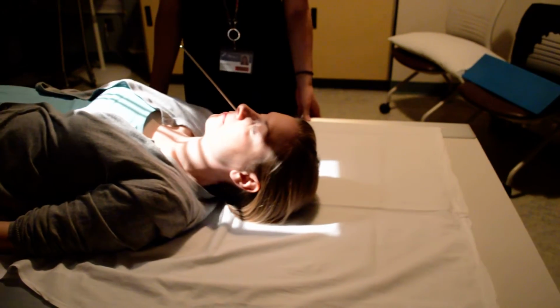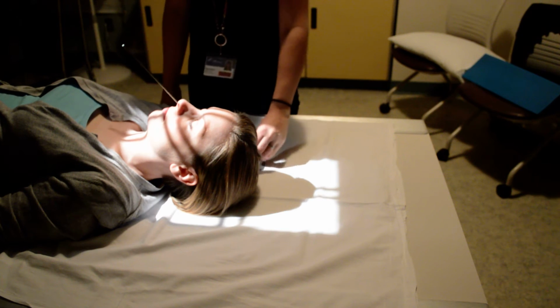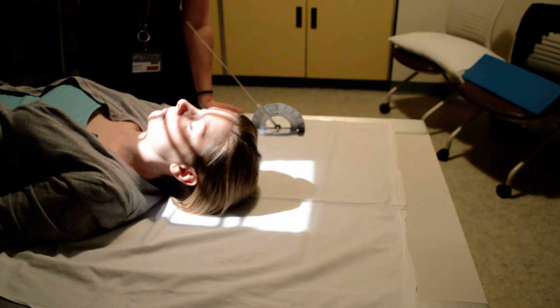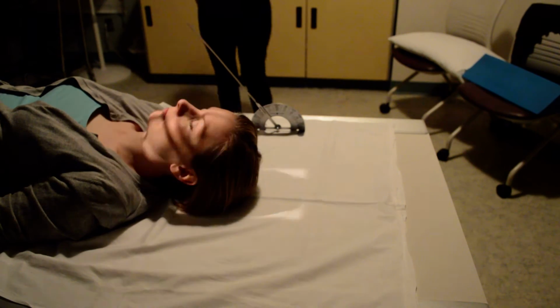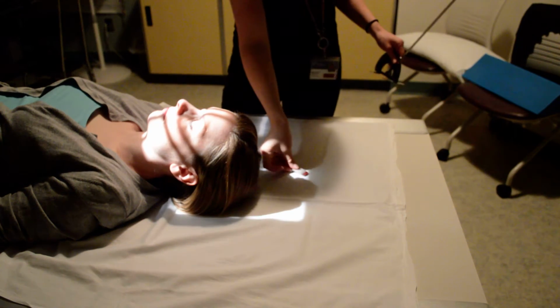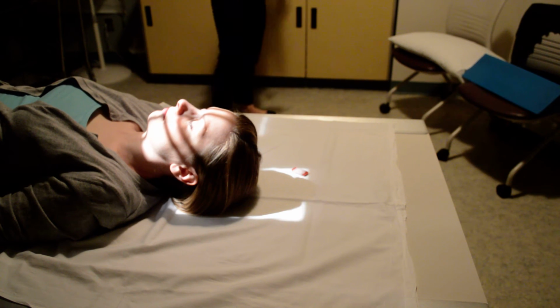So before, when we were doing reverse Waters, we were exiting at a canthion. This time we're going to be entering at a canthion, mid-sag, and then we can most definitely collimate to the outer margins on this. So it's okay for you to clip the vertex, just keep in mind you want to get that entire mandible on there. You can use a right or left marker, so I would just go ahead and put a right marker in my light field. You'll measure directly through your central ray and give your patient instructions. Ask them to hold still.